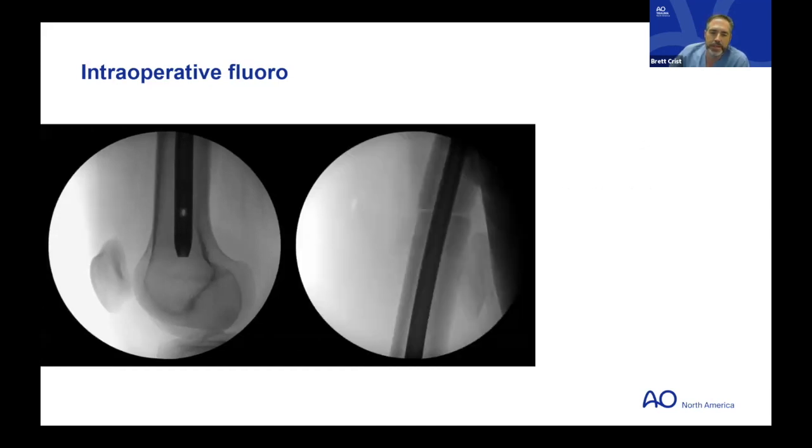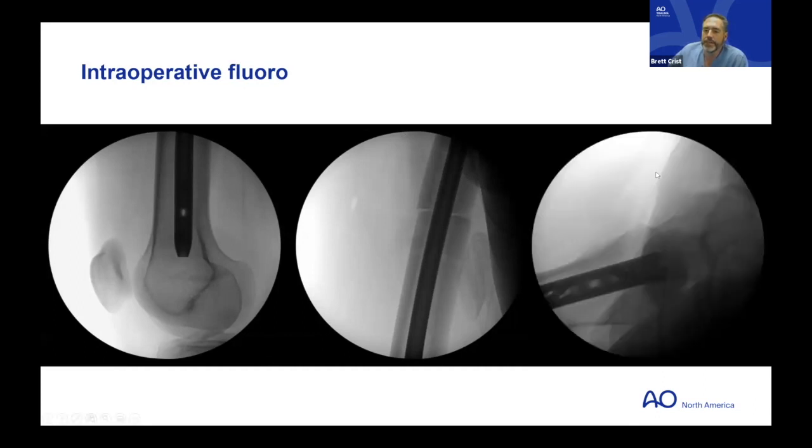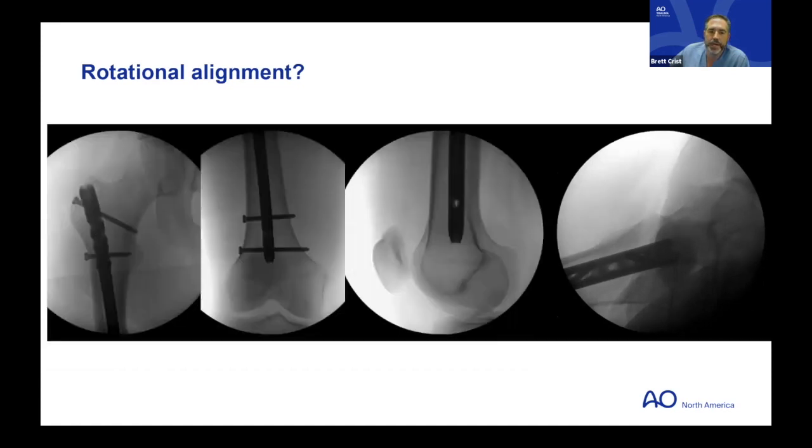This is just marching up the femur with x-rays at the fracture site. It's of interest. You can see that the cortical diameters aren't symmetric. And this is the proximal view here. And so how about the fracture reduction and rotation alignment based on these images? So if you take them all together, we don't have other contralateral images like Matt had, but these are the images that you have at the end of the case.